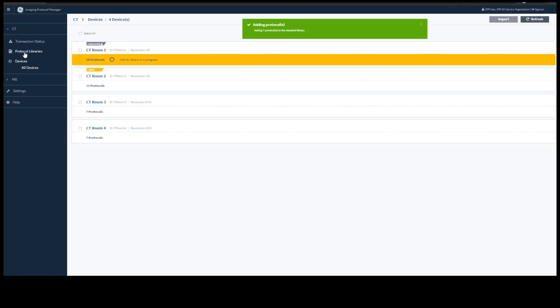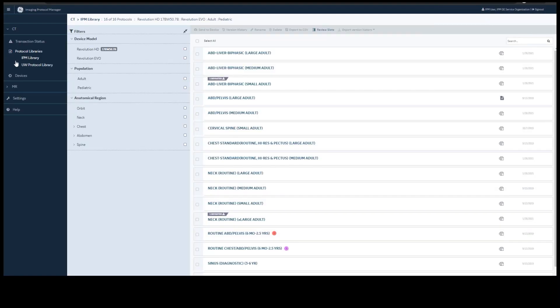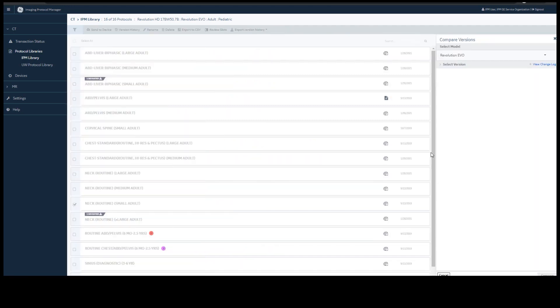The protocols will now be in your IPM library, which is your standard library. You also have version history. If you select a protocol and select version history, you will see all versions. You can look at the change log of that protocol.